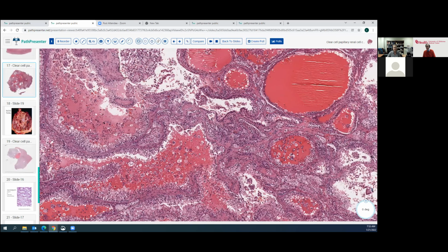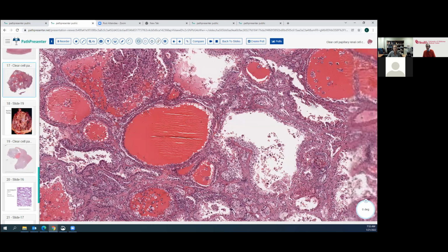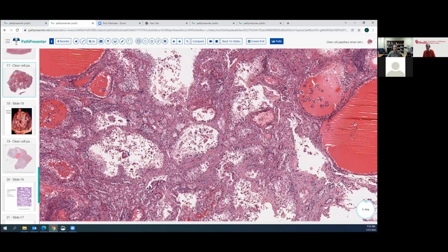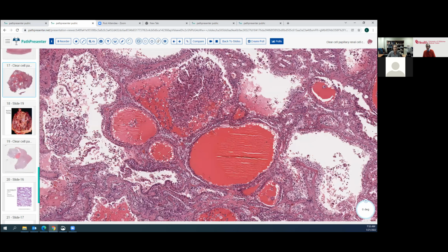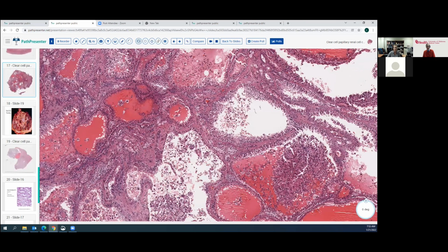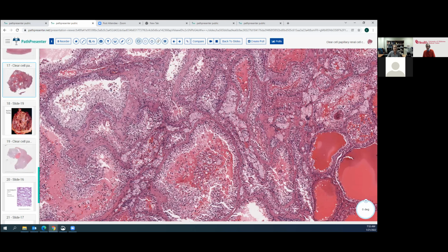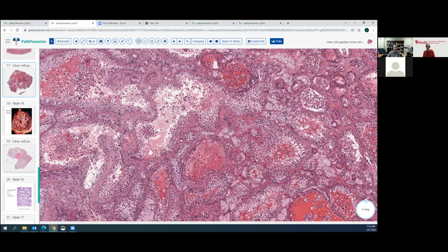And I wanted to mention this because papillary renal cell carcinoma very commonly does have coagulative necrosis. So not to be, again, confused with tumor necrosis. Even when you see coagulative necrosis, it's not going to be as associated with a poor prognostic outcome as if you were to identify tumor necrosis. So I usually tend to leave coagulative necrosis off my reports because sometimes it confuses my clinical colleagues, but it usually does not infer a poor prognostic outcome in these patients, especially papillary renal cell carcinoma, where it's a common thing.